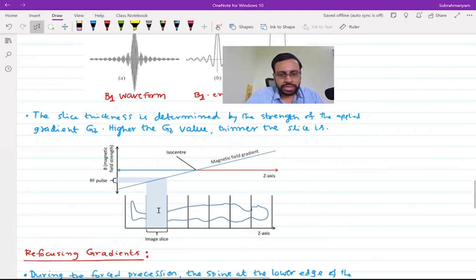So assume this is the location, and depending on the bandwidth, this is the line which tells you the Z. And this width here, I hope my cursor is visible, along the y-axis, the horizontal strip there, that's based on the shape. The central location of it is based on the frequency. So frequency and shape of the RF pulse would give you this strip along the vertical axis.